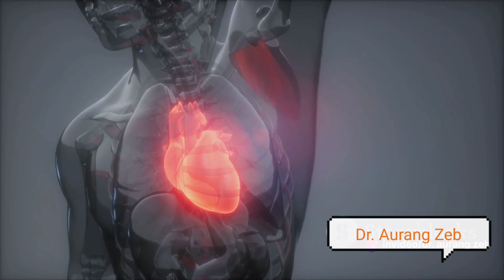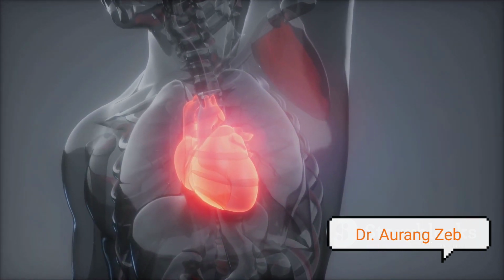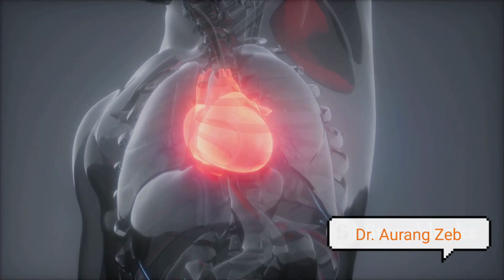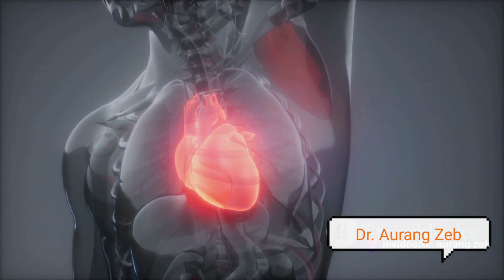But that's not all. We also assess the function of the heart. We look at how well the heart is pumping blood, how the valves are opening and closing, and how the septa are moving. This functional assessment gives us valuable information about the heart's health and performance.